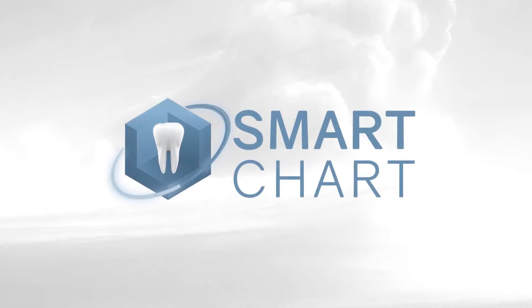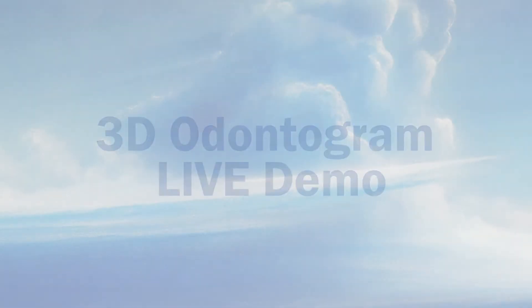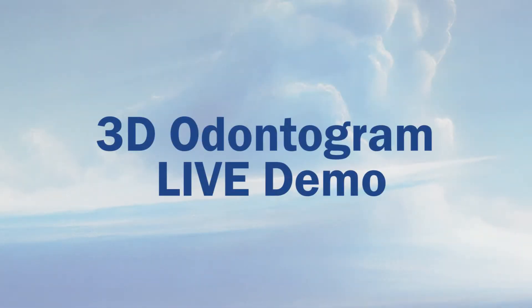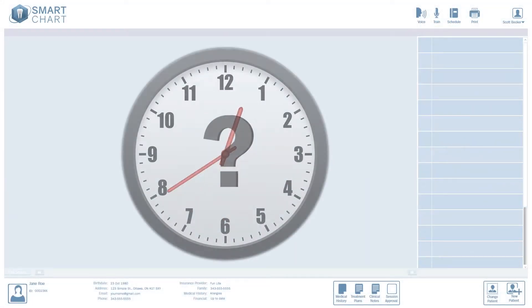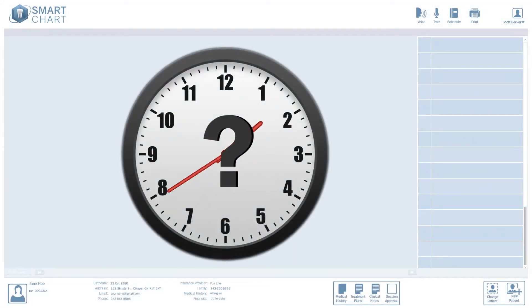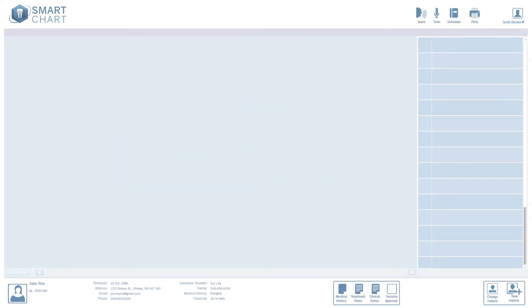Smart Chart. The future of dental charting has arrived. First, I want you to think for a second about how long it would take you to chart over 40 dental conditions, almost every tooth in the mouth. Okay, got it? Great. Now watch this.